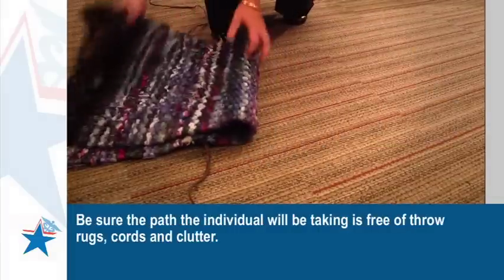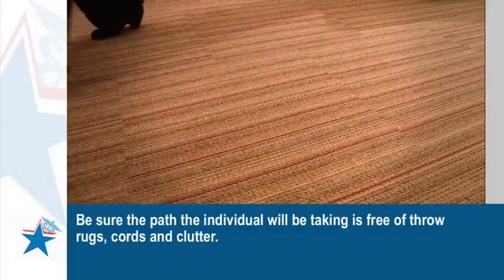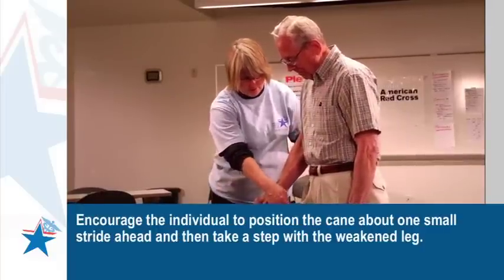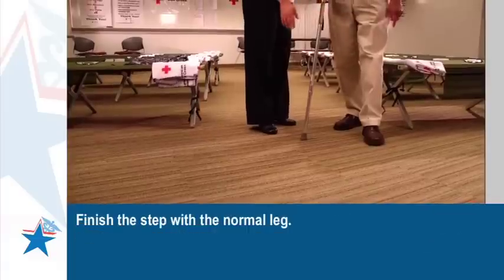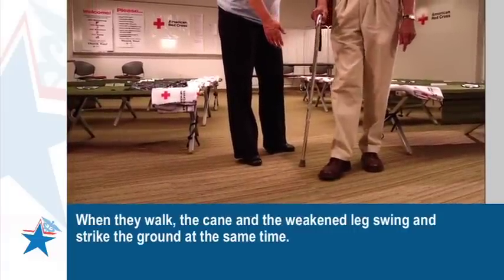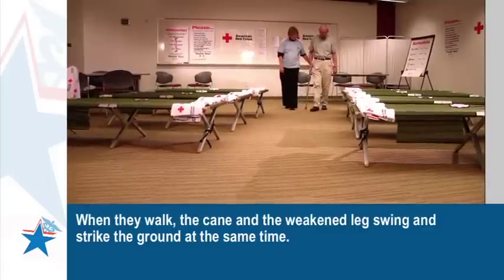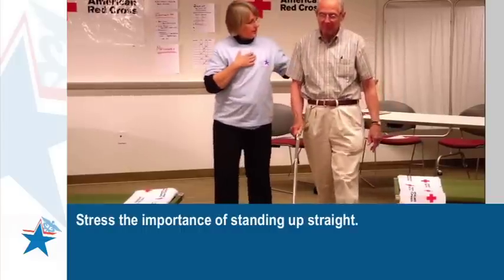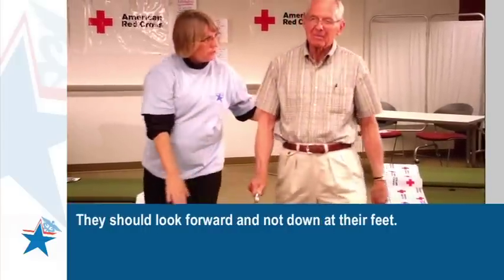Be sure the path they will be taking is free of throw rugs, cords, and clutter. Encourage the individual to position the cane about one small stride ahead and then take a step with the weakened leg. Finish the step with the normal leg. When they walk, the cane and the weakened leg swing and strike the ground at the same time. They should continue that pattern. Stress the importance of standing up straight.